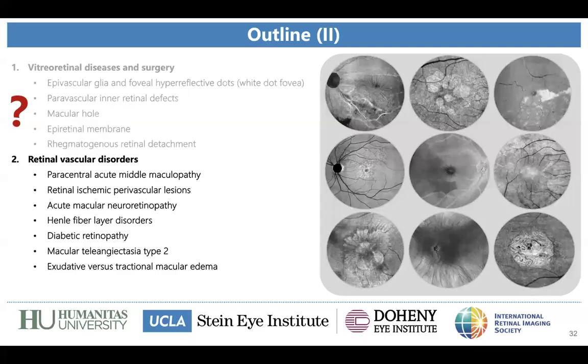I don't know if you have worked on that, but I've seen before in a conference, I don't remember who presented, the en face following of a macular hole, because sometimes we see the macular hole closing, but then in a second time, you see the outer retina closing afterwards, right? So you can follow the closure of the outer retina through en face, despite the macular hole being already closed by the OCT. Have you done something about it?